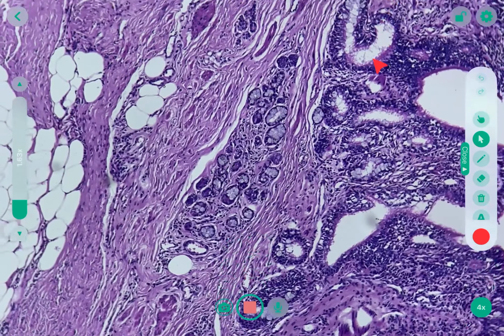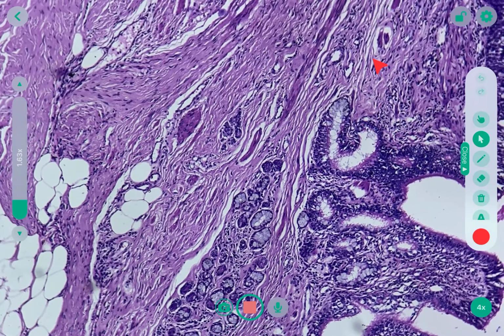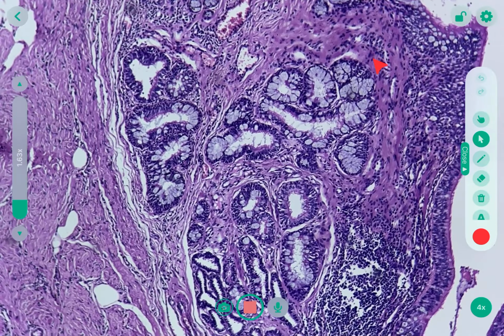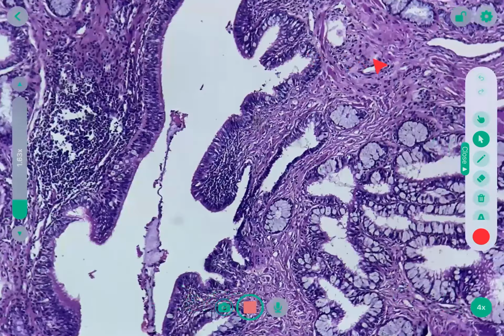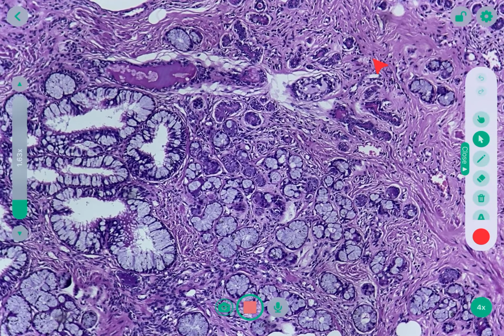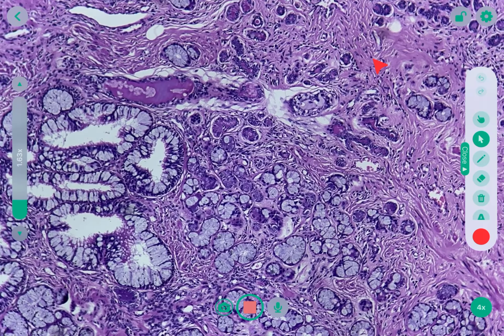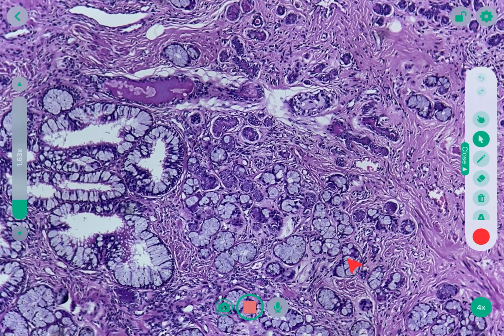Then we can appreciate this mucinous kind of gland. Actually seromucinous, both kinds of glands are there. Here these glands are serous glands, and these are mucinous glands. So seromucinous glands, especially along with ciliated epithelium.